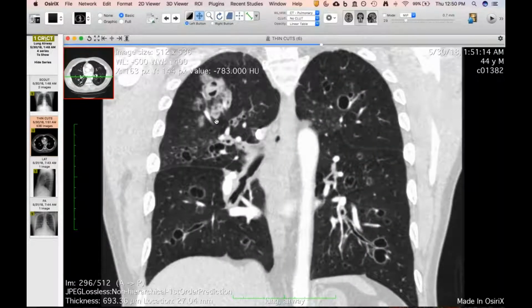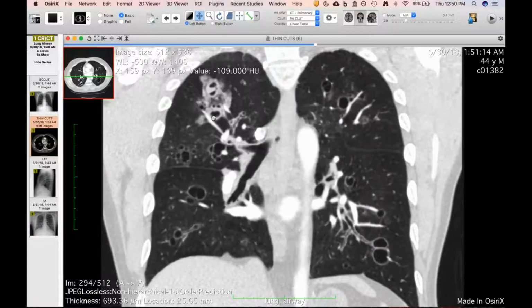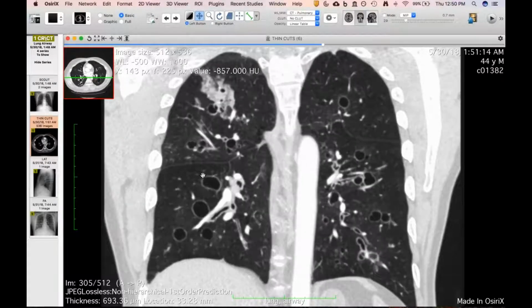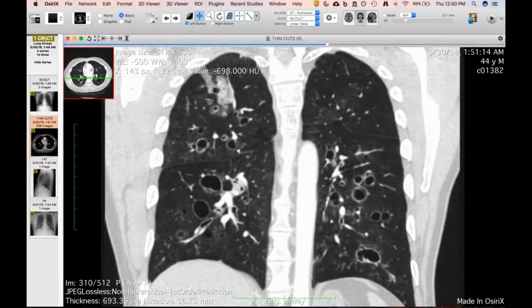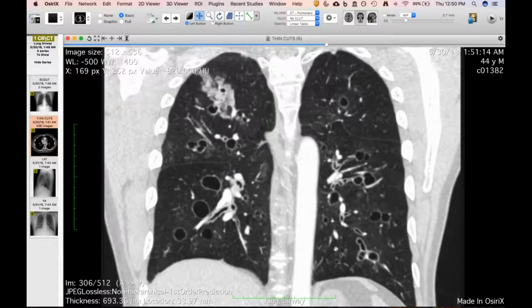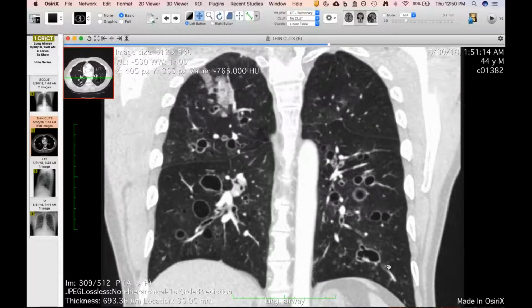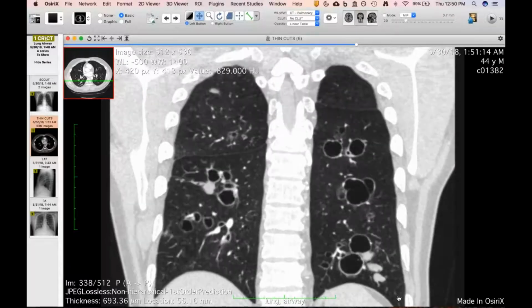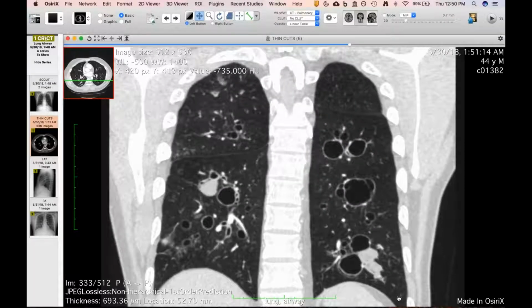Right. This is just his most recent pneumonia up here in the right upper lobe. So a lot of these cysts are not clearly connected to an airway for me. I mean, a lot of them seem to be just sitting out there. If there's an airway going to them, it's pretty small, and then this sudden dilation. This is very strange. I don't think this fits any described pattern that I've ever seen before. Okay. It's not a slam dunk.